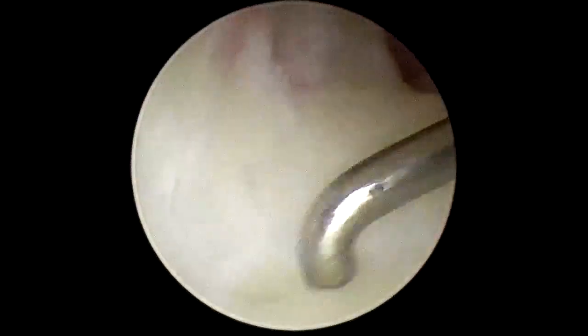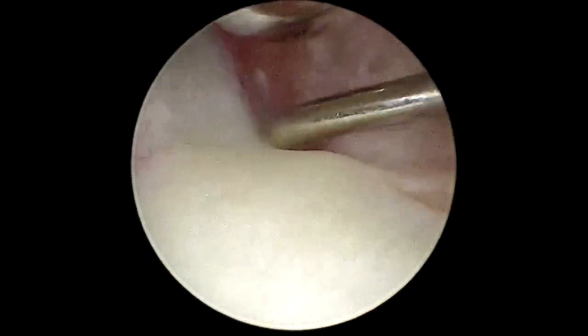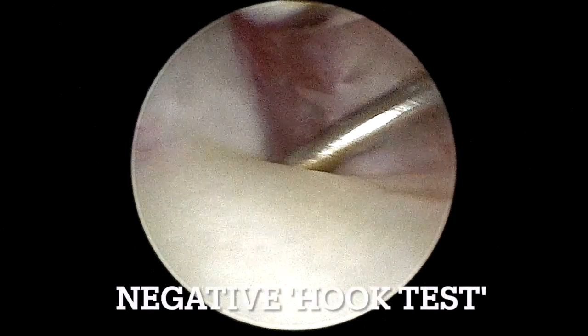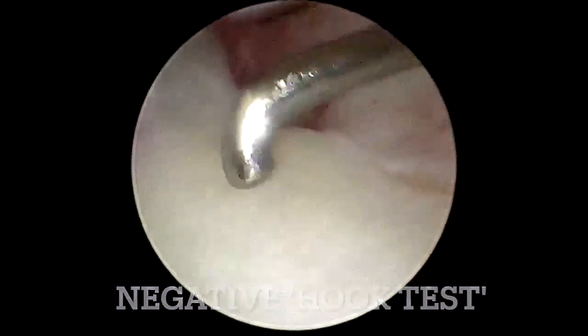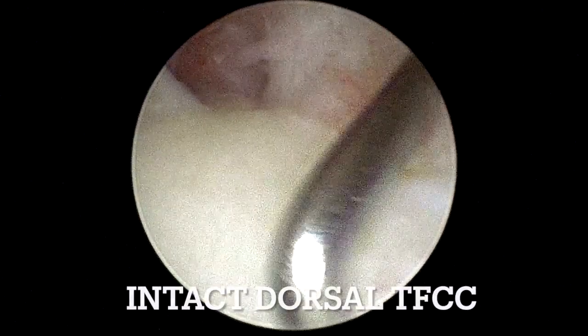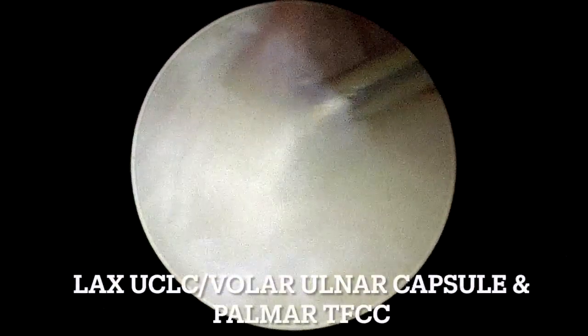A 30-degree 2.4 mm arthroscope is introduced into the 3-4 portal and a probe into the 6-R portal. The probe is used to assess the TFCC status with a trampoline and a hook test. In this case, the patient had a negative hook test but a laxity at the palmar TFCC.